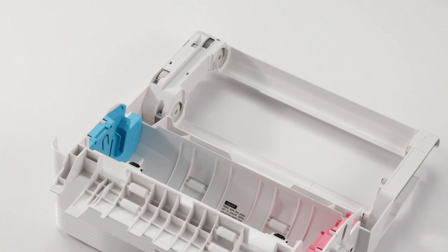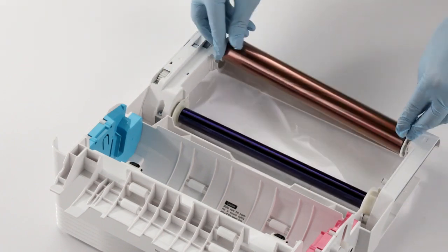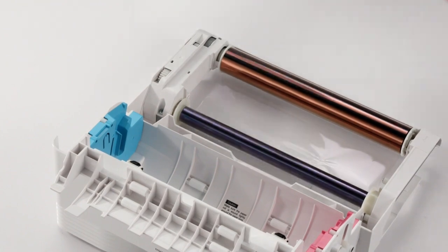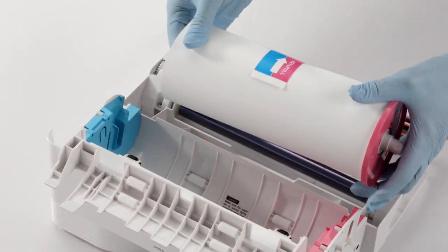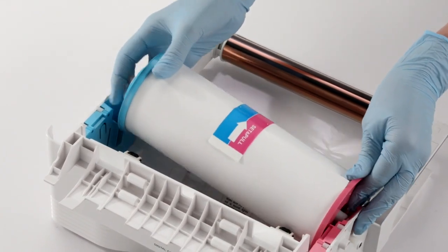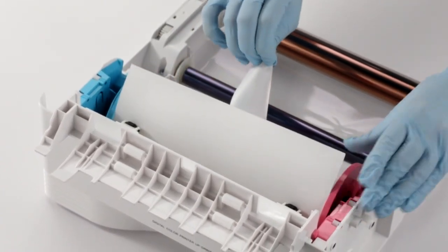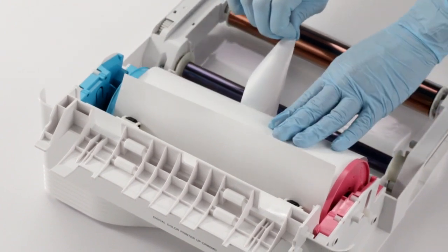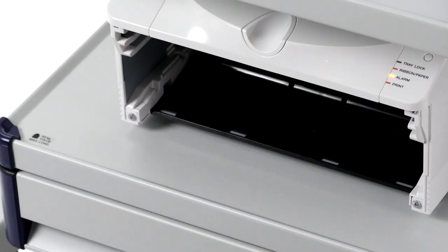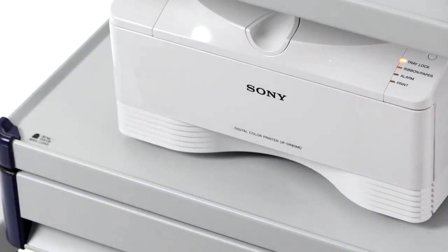Next, separate the two spools of the ink ribbon and load them in the media tray, keeping in mind the positioning. Pink and blue paper holders were provided with your printer. Set the selector for the blue paper holder. Insert the ends of the paper roll into the holders. The pink paper holder should be at the end with the matching pink adhesive label, and the blue paper holder by the blue label. Load the paper roll in the media tray and carefully peel the adhesive labels from the paper roll in the direction indicated by the arrows. Then insert the media tray into the printer, making sure to push it until it clicks into place. Now you're ready to print.